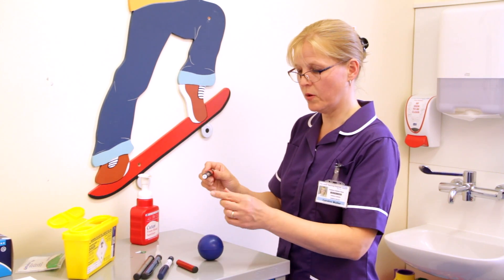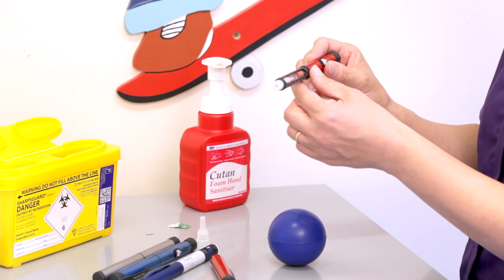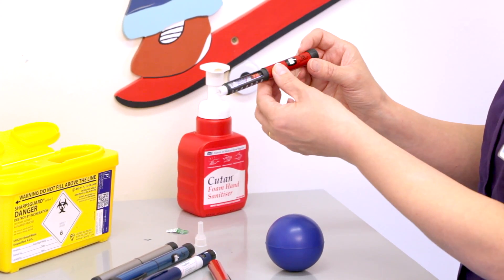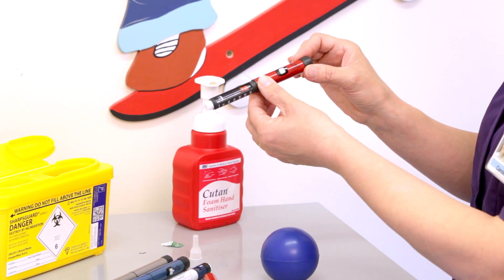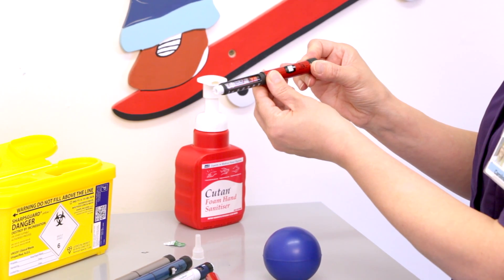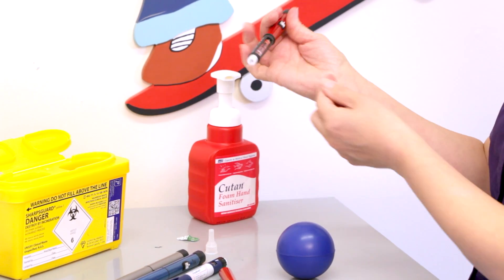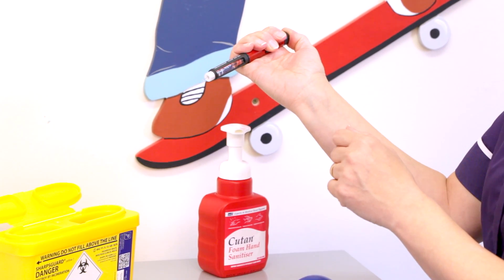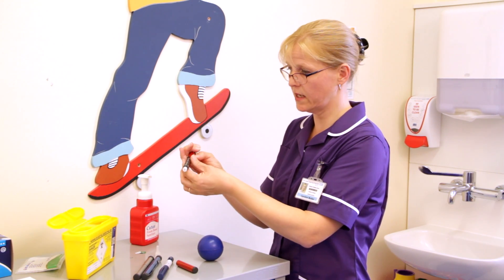When you put a new needle on it's important that we fill the needle up using what's called an air shot. To do an air shot, you need to first pull the cap out, dial up to two units, and then push the plunger until you see a drop of insulin out of the needle. If you don't see a drop of insulin it's important to redial.